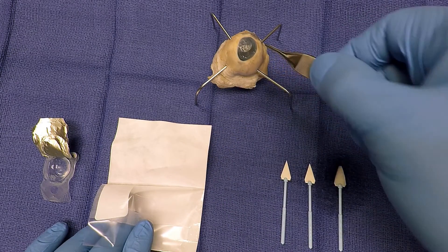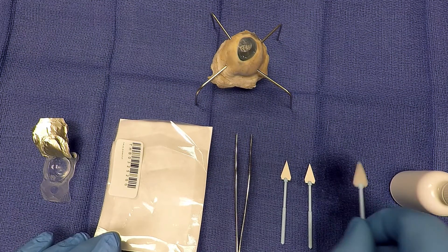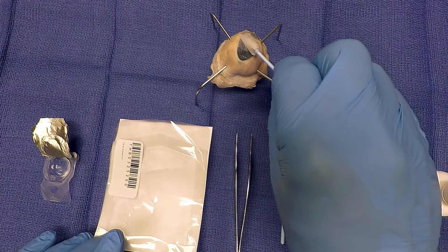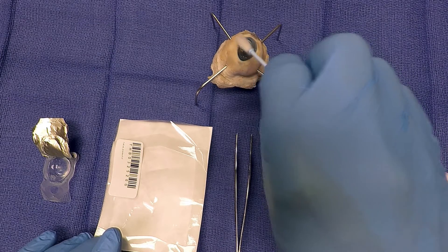The Eclipse can be applied in either direction with no orientation issues. After it is in place, take your soft cell sponge and smooth out any raised edges of the graft. Make sure all edges of the disc are smooth and in place on the ocular surface.